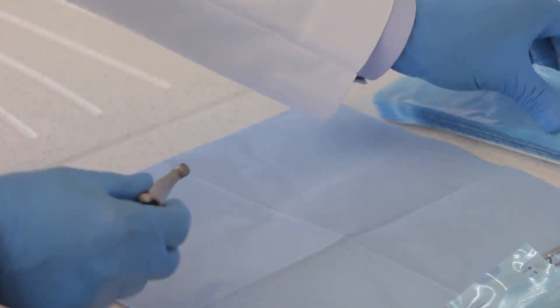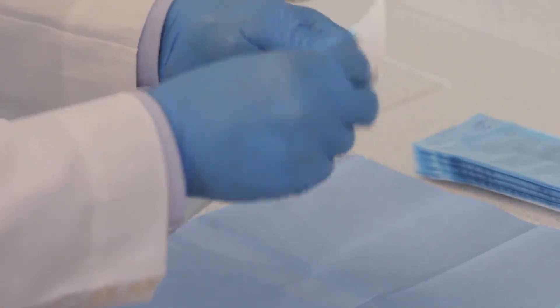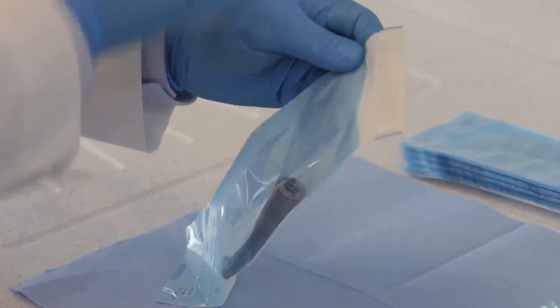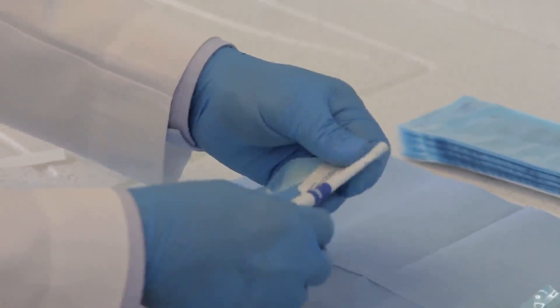Autoclave sterilization is recommended. Insert sterilizable components into a US FDA-cleared sterilization pouch compliant to ISO 11607-1. Seal the pouch.